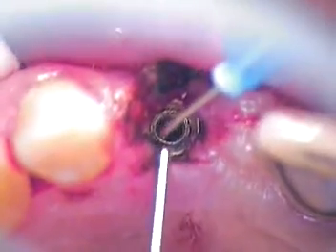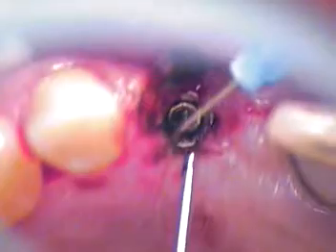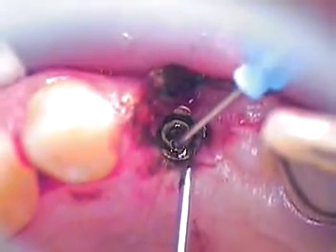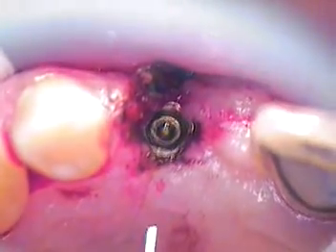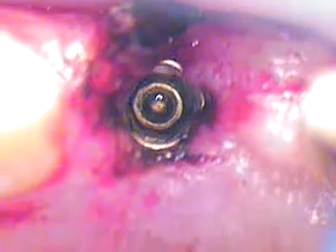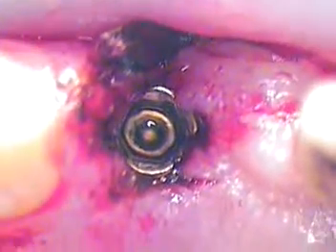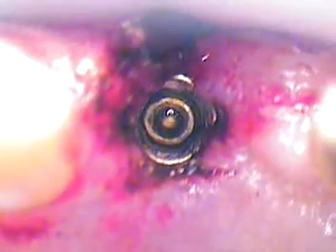And just stay right there. I'm just going to put a small amount in. There we go. Let's just see if anything bubbles up from that. All right. You okay? All right. Let's zoom in. And basically, if there is any tartar in there, we might be able to see it. So, any bubbles coming up? I don't really see any bubbles. So we just verify that is TS tartar and stain. Correct on that? Yeah. Okay.